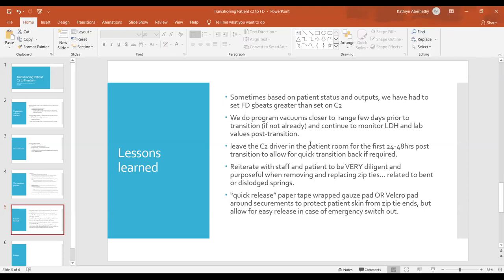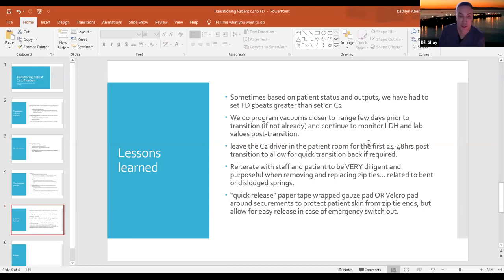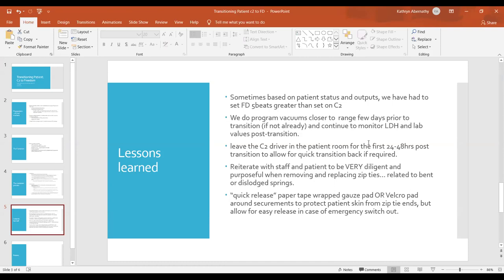We looked specifically at our LDH and trended those. There are occasions where they will get TEGs in the beginning, but that's not routine for us any longer. We watch the hemolysis with our LDHs, making sure they're trending in the general direction, not in extremis. So would you say you use your TEGs to help determine how much aspirin or other antiplatelet regimens you're using? At initiation is when we would use those, when we're initiating those. Perfect, thank you.